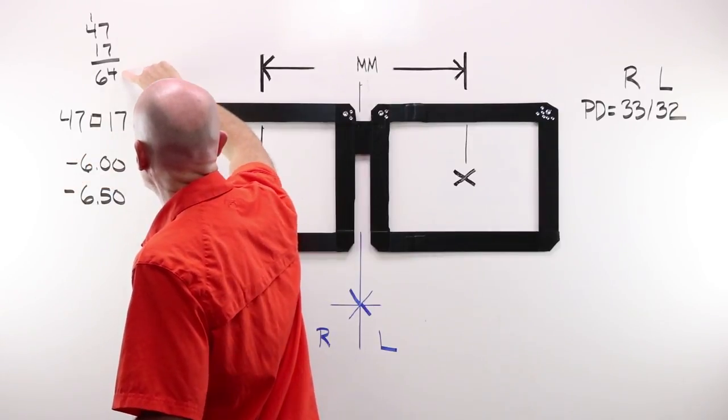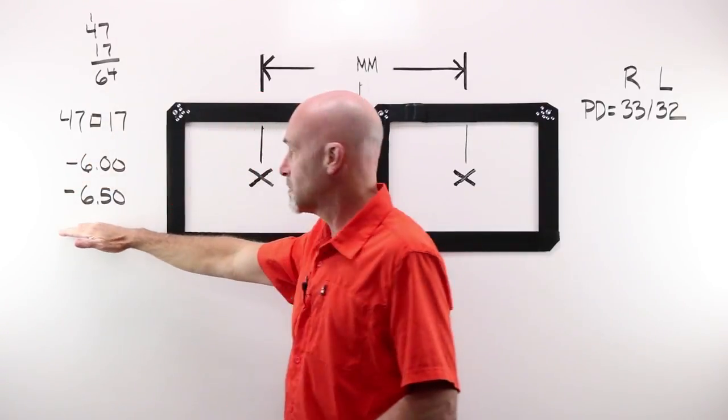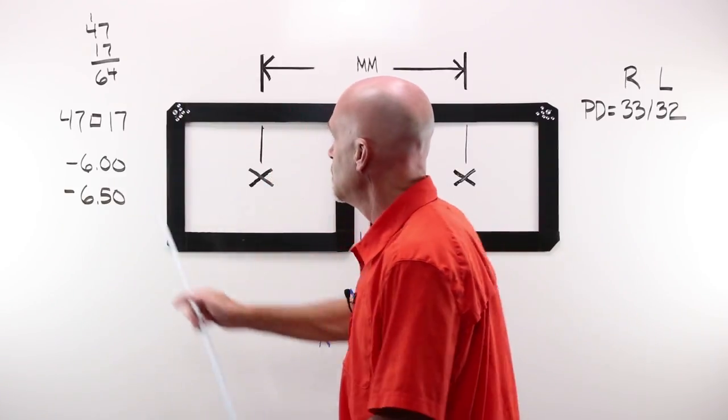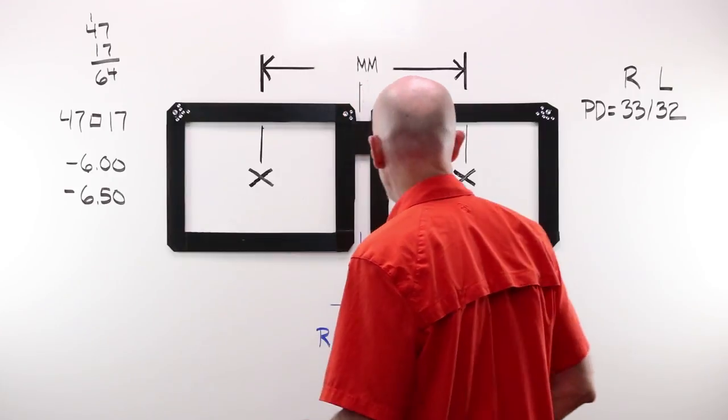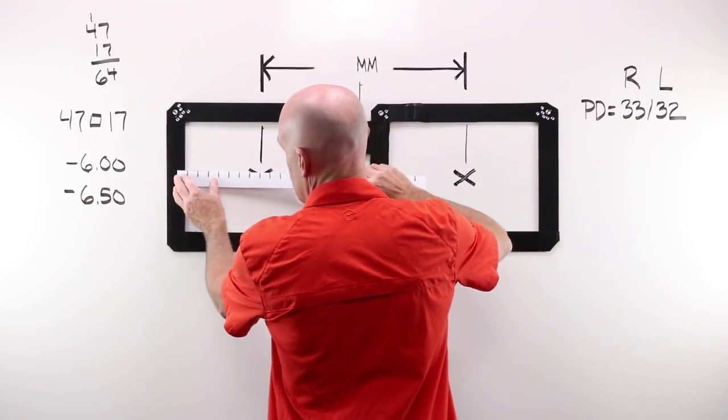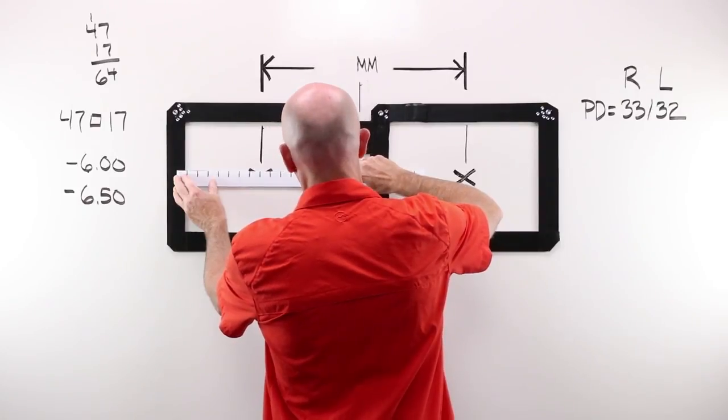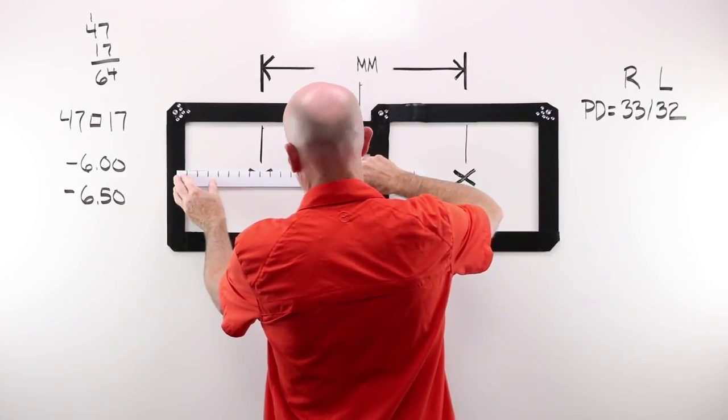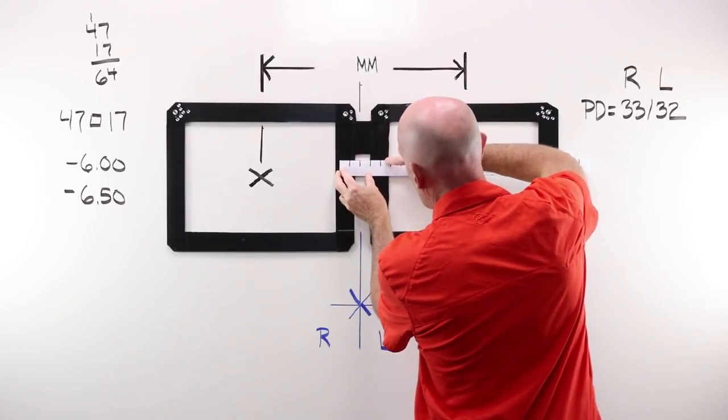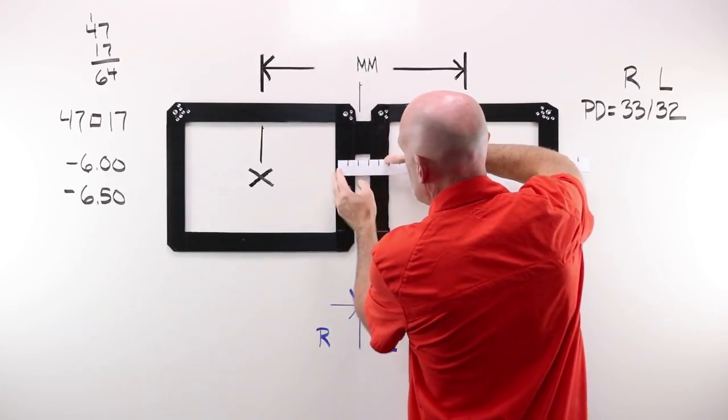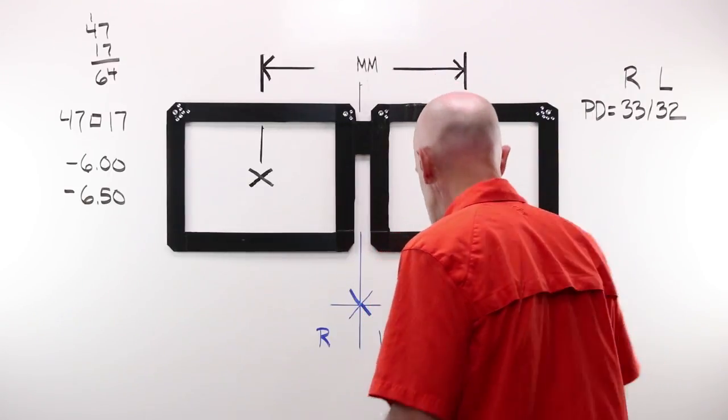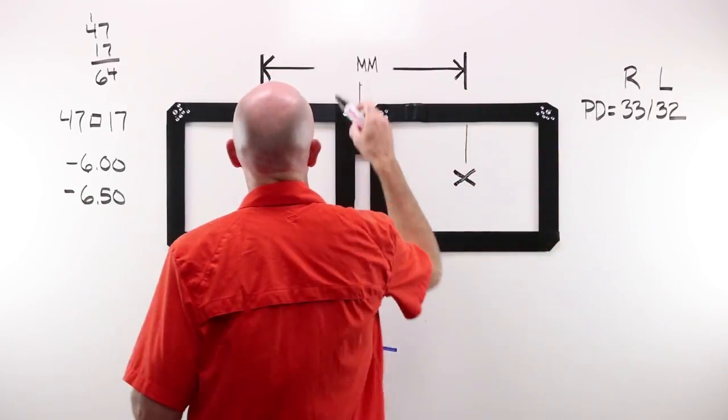I have SuperFrame. SuperFrame has a boxing system measurement of 47-17. 47 and 17 gives me a total of 64. My powers are getting up there. I'm going to be super careful about what I do. I'm going to make sure that 47 and that 17 are correct. Take out my PD stick. The only time we use a PD stick, I'm going to check my A, which is 47, and I would check my DBL. A nice 17, so we're good there.